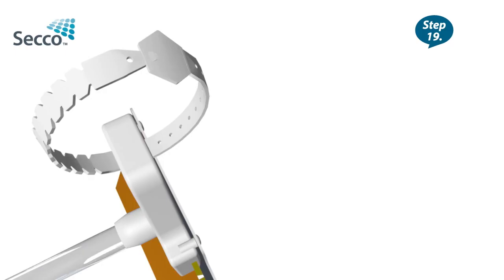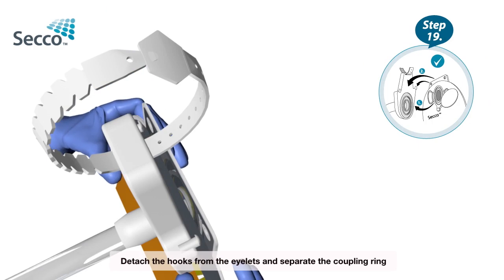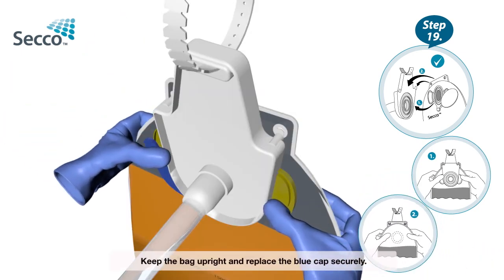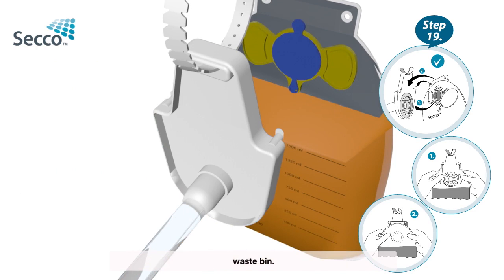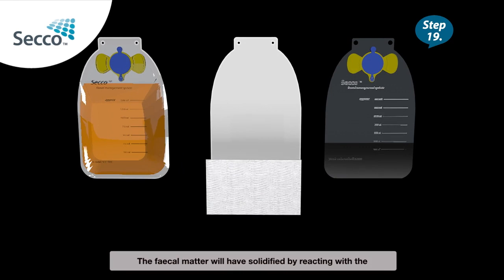Step 19 – Changing the bag: Detach the hooks from the eyelets and separate the coupling ring by lifting the tab slightly. Step 20: Keep the bag upright and replace the blue cap securely. Dispose of the full bag in an appropriate biohazard waste bin. The fecal matter will have solidified by reacting with the superabsorbent in the bag, therefore eliminating the risk of spillage. The bag cannot and should not be emptied.